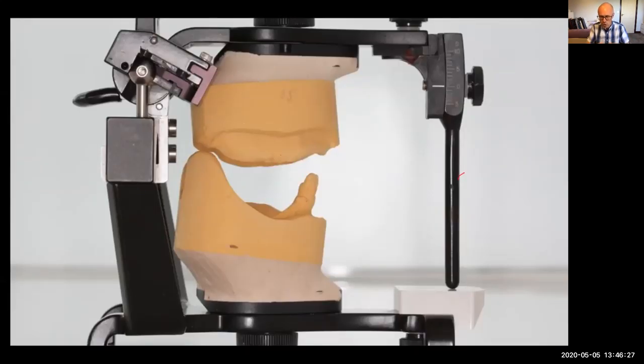The other issue with implants, which I feel very strongly about, is this. This is Anne, and Anne's got a complete upper denture there, and we've used all of the different techniques. We've carved the rim to get the teeth in just the right place, using lip support and incisal plane, and also occlusal plane, which is parallel to the alar tragus. Now, when we trim all these things, we often find that at the back of the upper denture, when everything looks superb like it does for Anne, we've got very little space for stuff at the back.